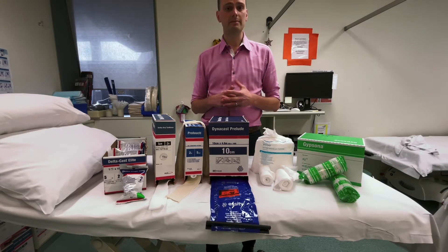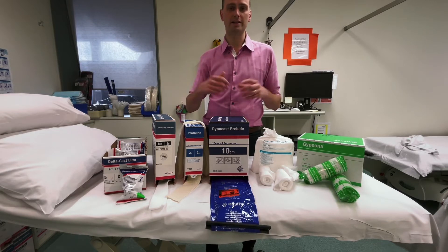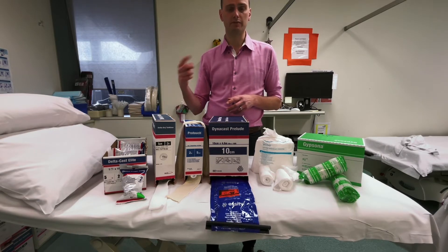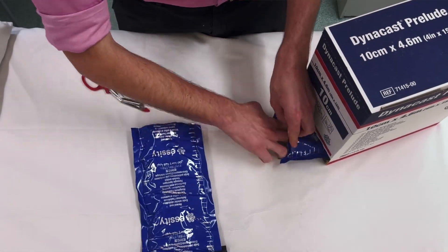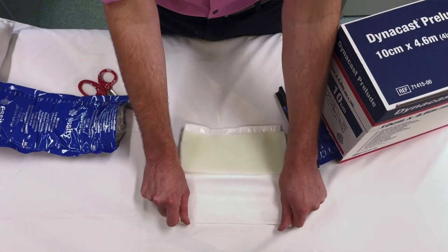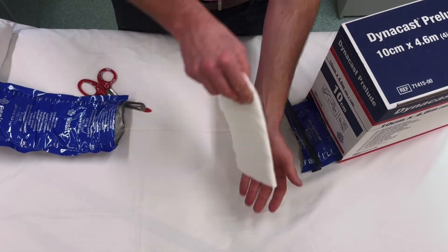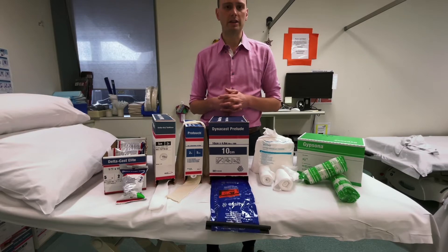When it comes to backslab materials, most people still use plaster of Paris and just unravel the roll to make a wad of plaster in a rectangle. One synthetic alternative is a polyester material that comes as a wad in a protective coat of cotton. It can be cut to shape, sprayed with water or dunked, placed inside felt, and then placed on the limb with some crepe — making it a little quicker, easier to remove, and less prone to damage.